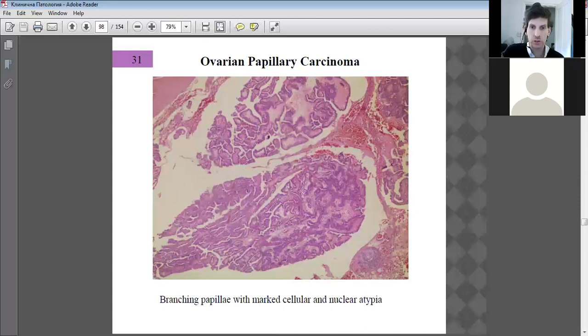Lots of branching occurring in this mass here. All this here is blood, but this is the growth of this carcinoma or tumor. There are examples we can see of necrosis there. There's necrosis in it, so this is definitely a rapidly growing invasive tumor.